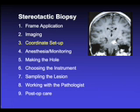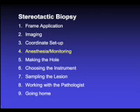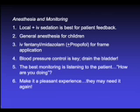It's important when the coordinates are set up that they are triple checked to ensure that the correct numbers have been used. Once this is done, surgery can begin. Under anesthesia, it is often best to use local and IV sedation, and this allows patient feedback to be maintained. For example, if a blood vessel is ruptured and there's bleeding starting, the patient can complain of a headache, and the procedure can be stopped and appropriately managed.